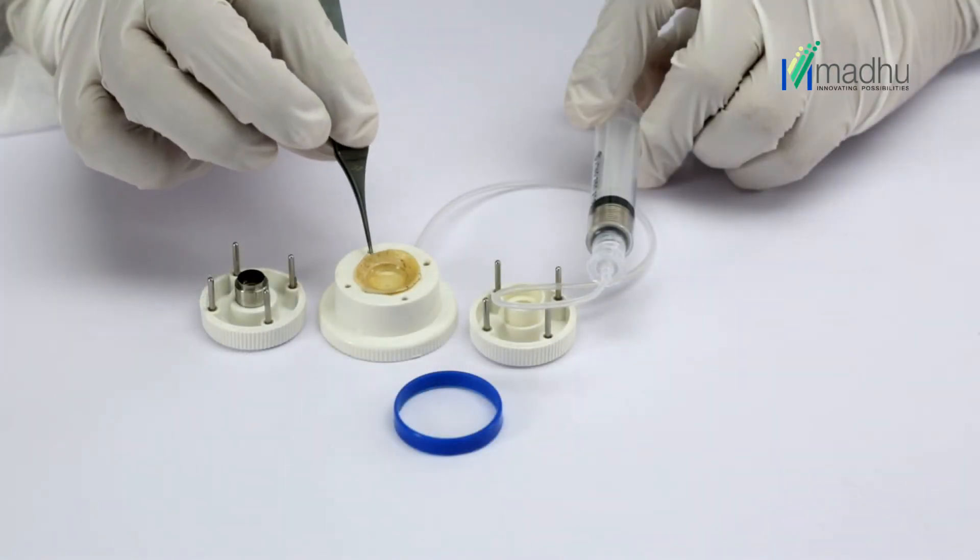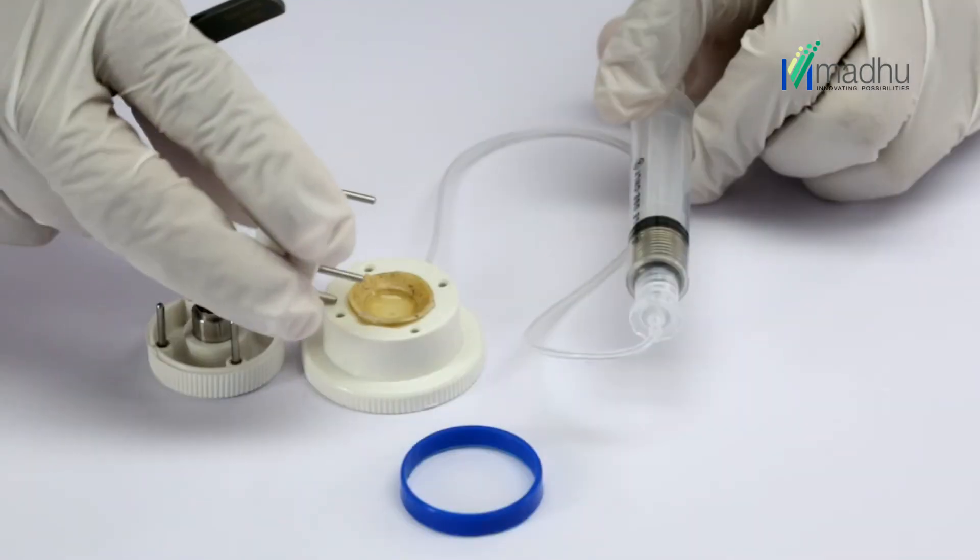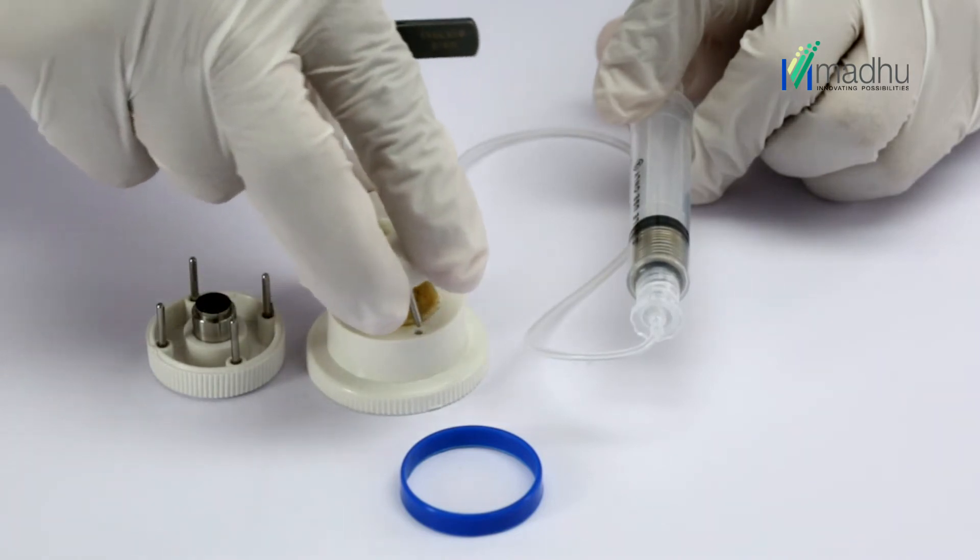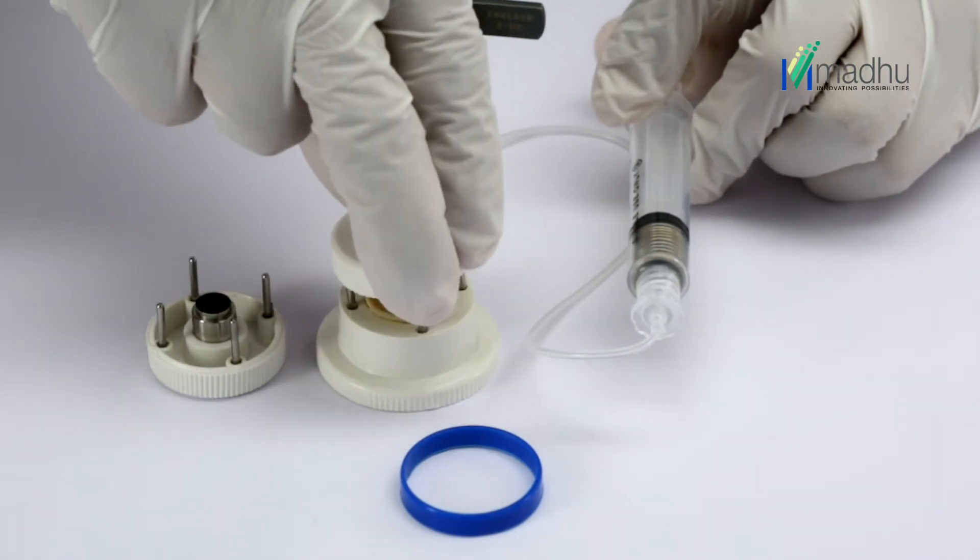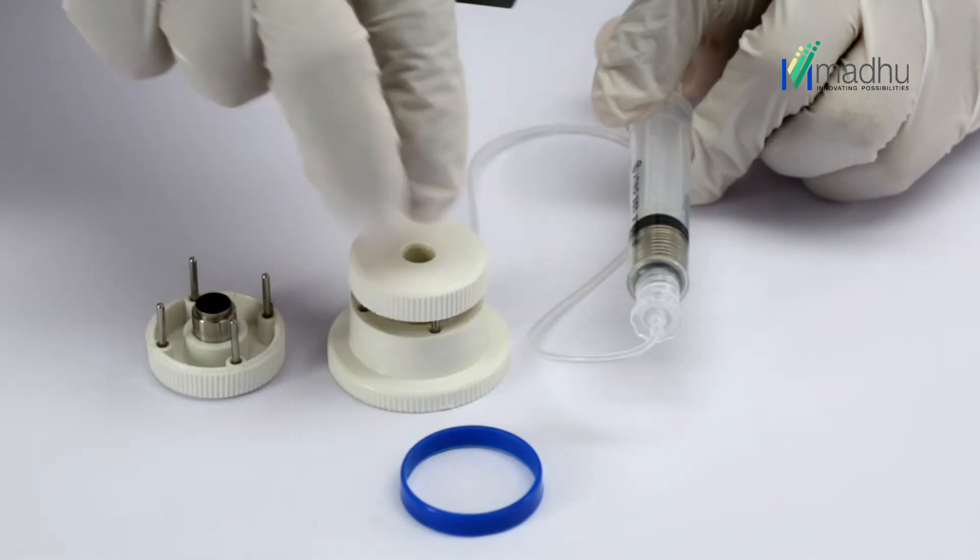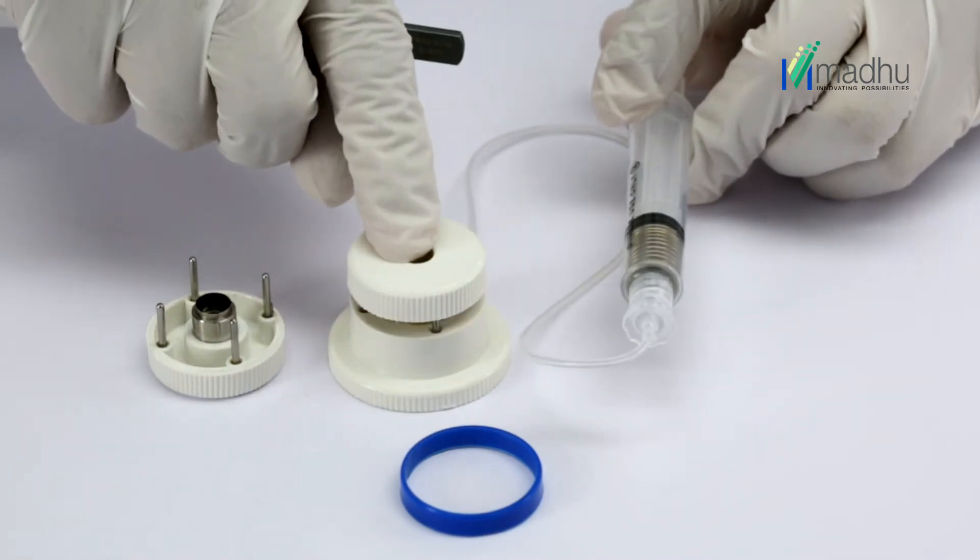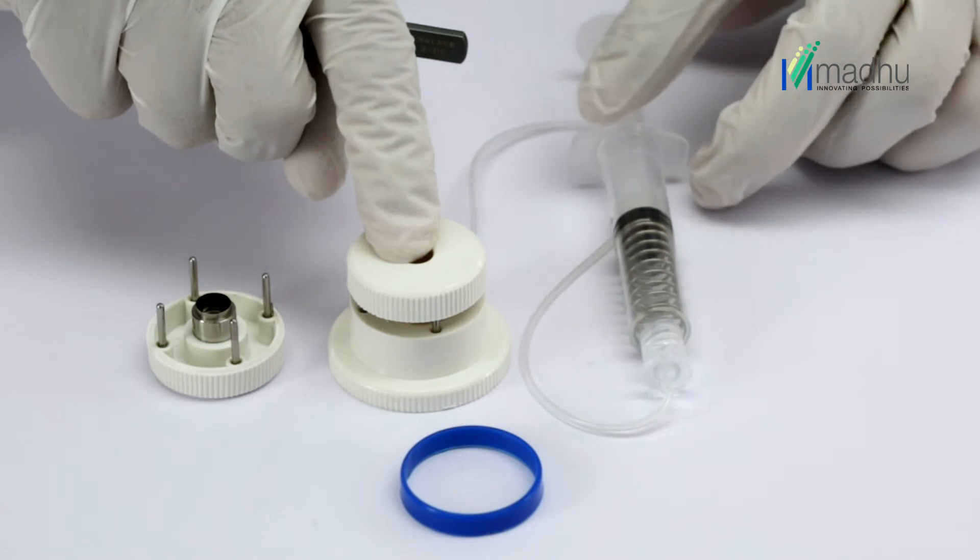Center the donor cornea with a fine-toothed forceps. Insert the four stainless steel guide pins of the sitting ring housing into the cutting block corresponding holes and press down gently. Release the plunger of the syringe abruptly to create vacuum and hold the cornea firmly onto the base.